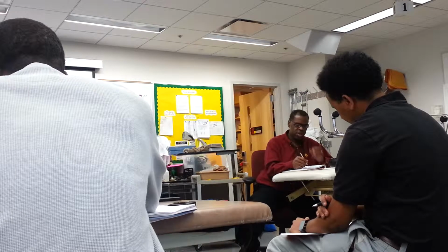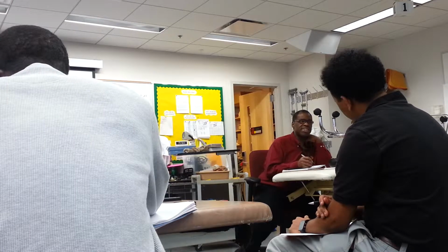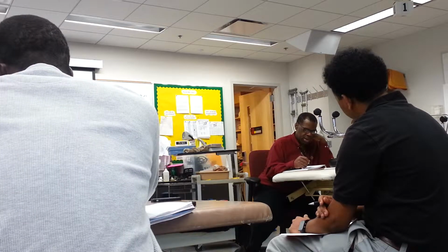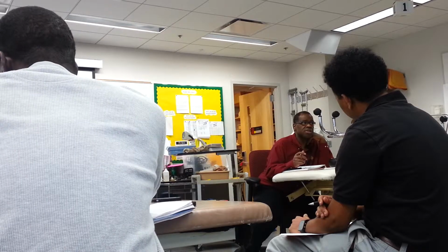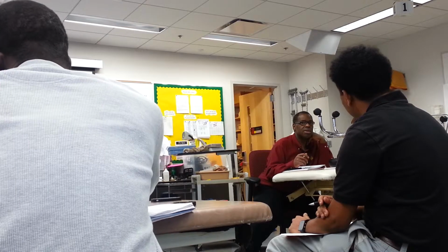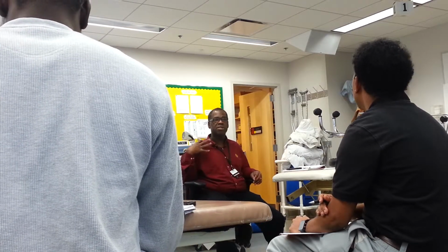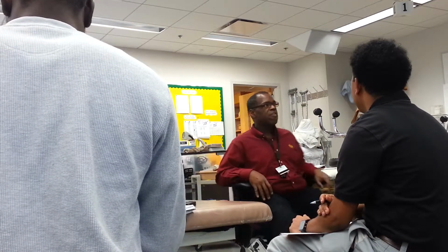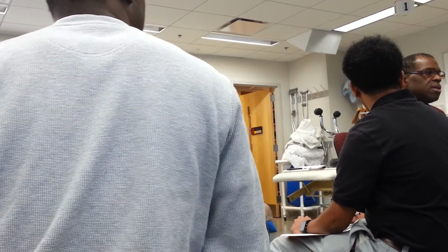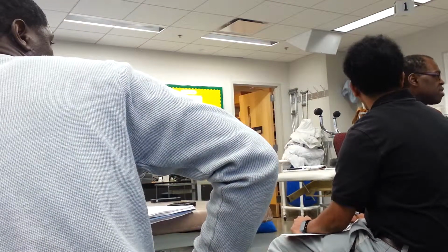All right. If we want a twitch, let's go with twitch. What should the intensity be? Motor, good. Pulse rate, if we want a twitch. All right, let me go back. Pulse width, if we want a twitch. 200, good. All right, now, if I'm going to do a twitch, what is a twitch? So what's the pulse rate? About 2 to 4 pulses per second.